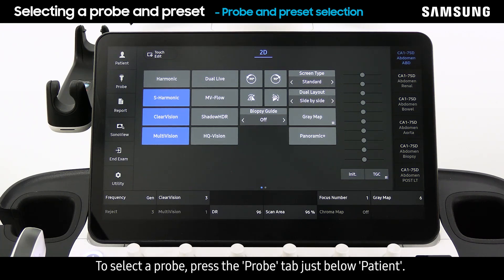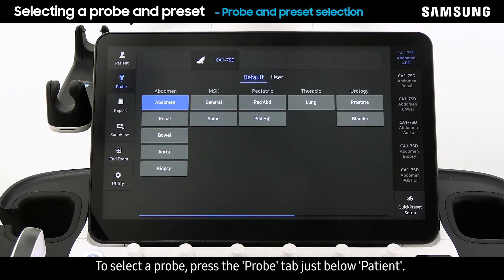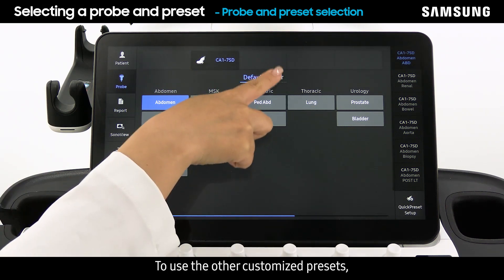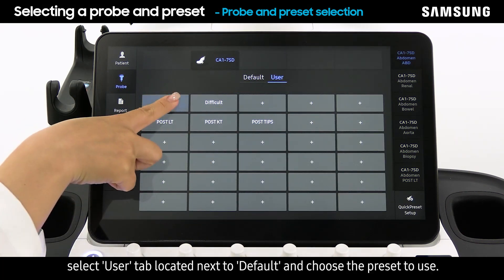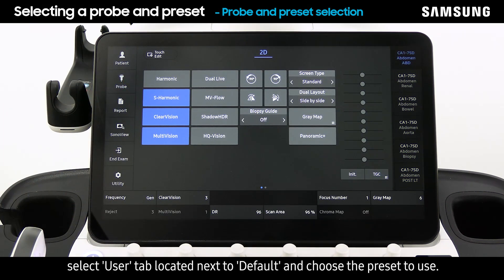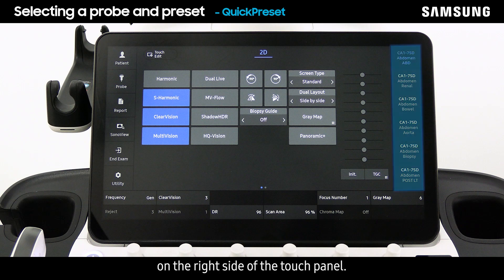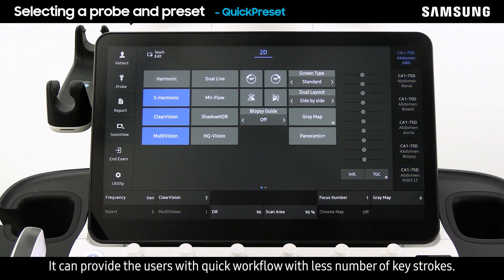To select a probe, press the probe tab just below patient. The connected probes and available factory presets for each application will be displayed on the touch panel. To use other customized presets, select the user tab located next to default and choose the preset to use. The most commonly used six presets can be configured on the right side of the touch panel, providing quick workflow with fewer keystrokes.